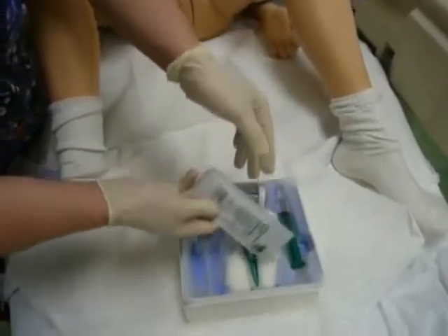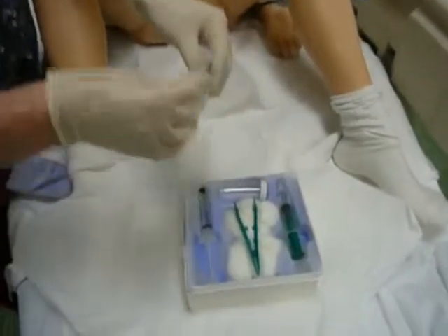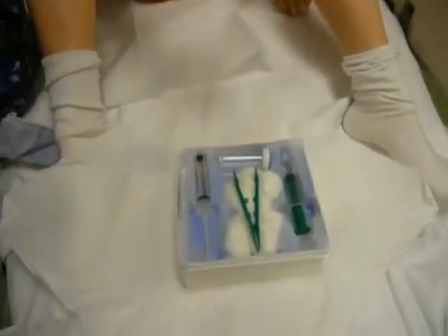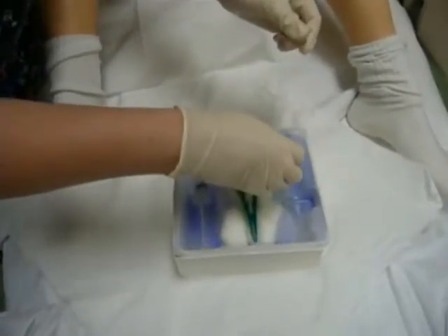And you pour it over your cotton balls, come over here and drop it on your sterile field. Here's my lube — my lube gets squirted into this container right here.